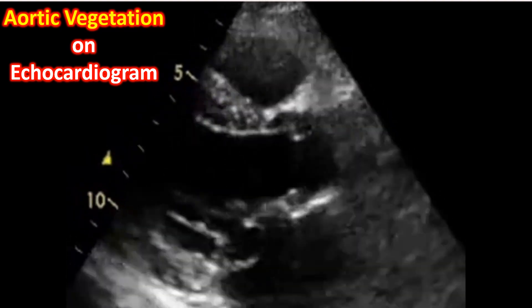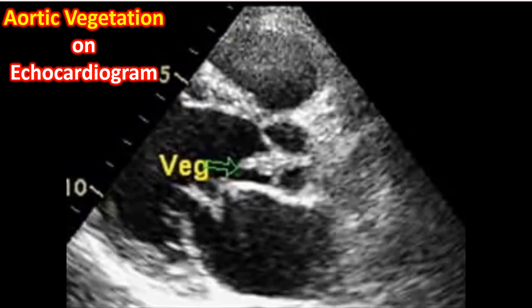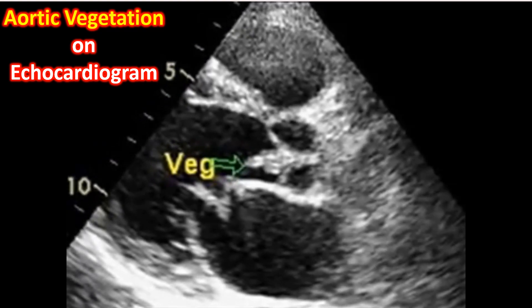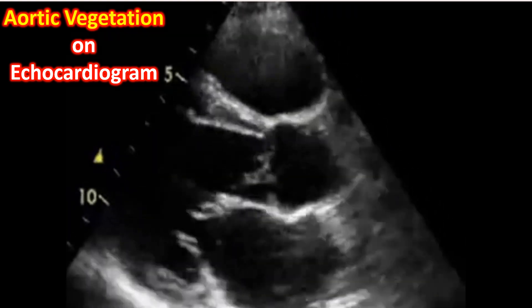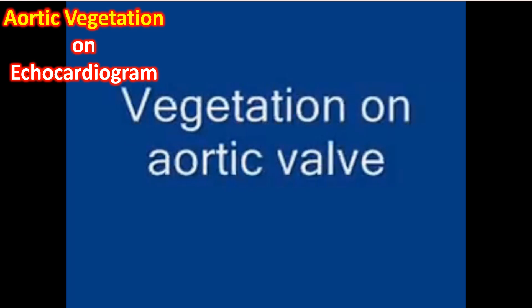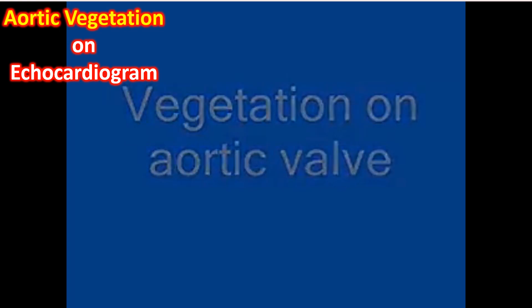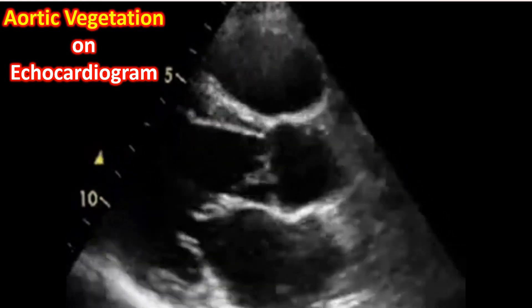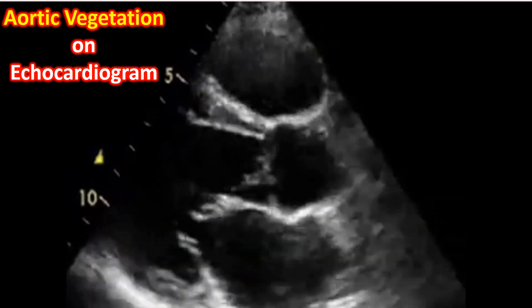Here is an echocardiogram in parasternal long axis view showing vegetation on the aortic valve which is prolapsing into the left ventricular outflow tract during diastole. You can see it very nicely. It is a fairly good sized vegetation in a case of infective endocarditis.